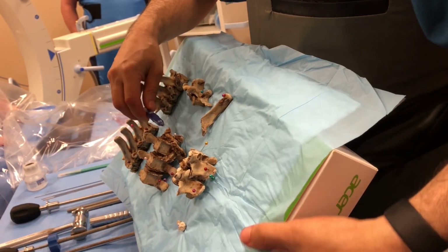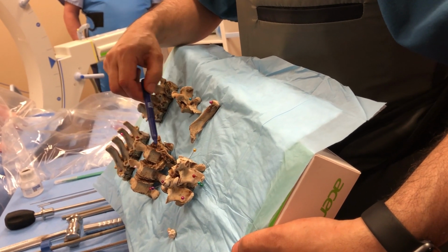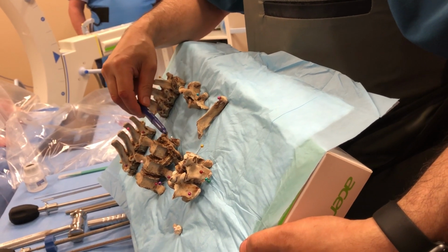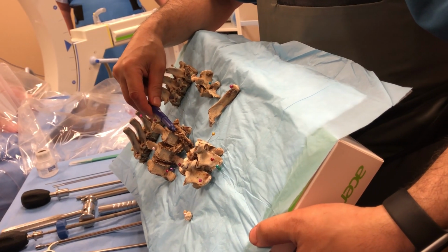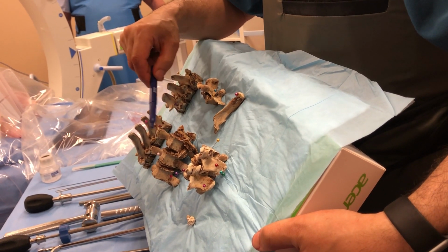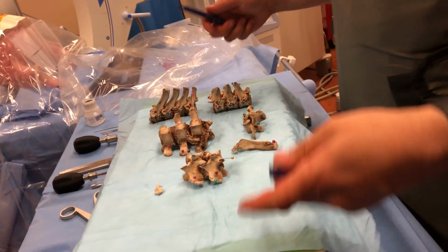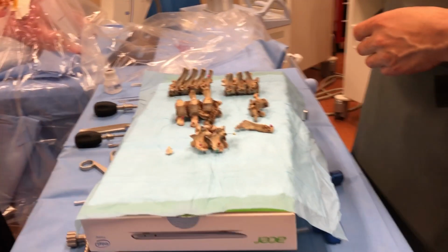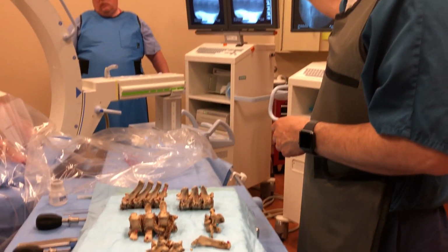With the usual OLIF approach, we knocked off the front of the bone, because in a human that would be perfect, because the bone would be coming like that. But here in the pig, since it's shallower, it's going this way. The angle is perfect, but there's not enough substance to hold it. But once you have this consideration and you work it into your approach, I think at least in a good sized pig like this one, this is even better. This is a little bigger pig.